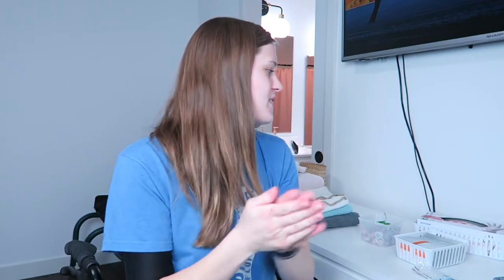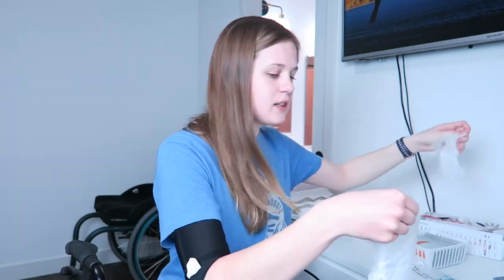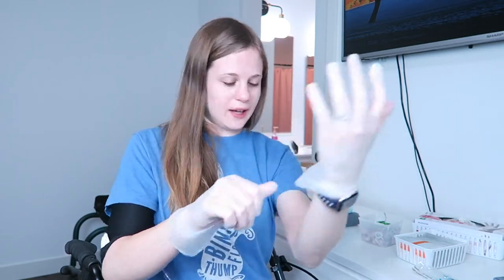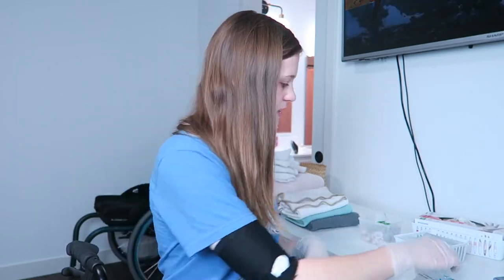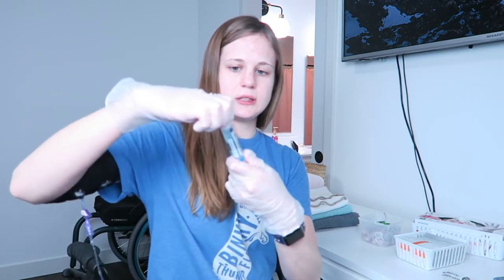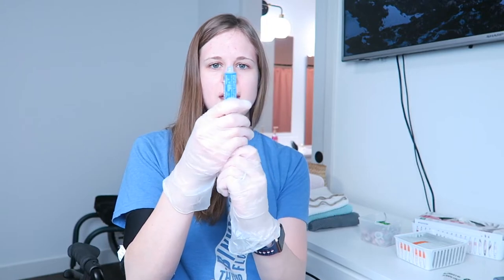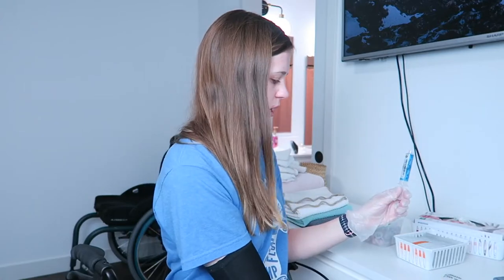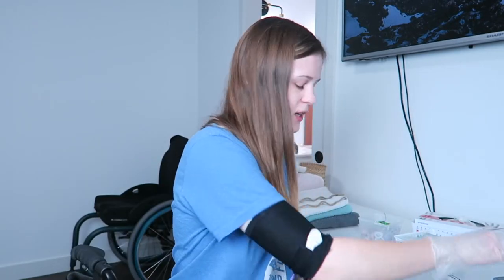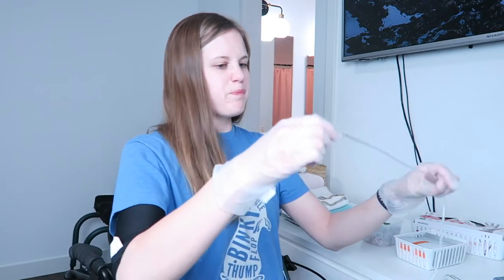All right, hand sanitizer on. Hopefully that didn't just hit the lens. Okay, got that. Next, gloves on. Then we're gonna go ahead and take our heparin and prep that. So take the cap off, put it upside down or right side up, whatever. Pull back and get the air out. Go ahead and put the cover back on. Place that down. Then we're gonna go ahead and unclamp this because I had clamped it.